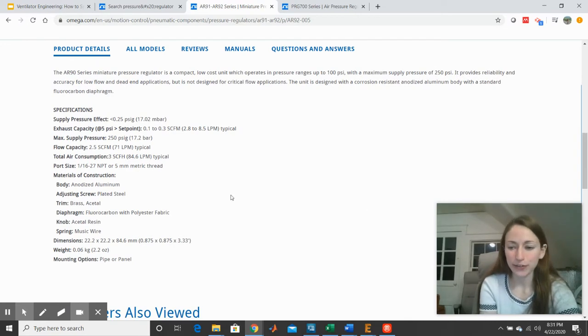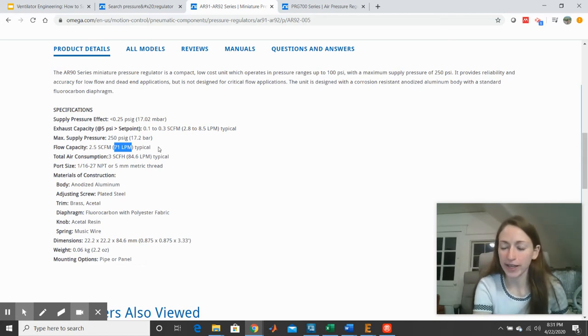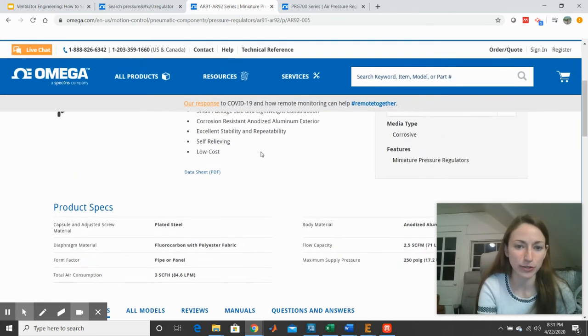And immediately, the first thing I'm going to look for is the flow capacity, because my suspicion is that it will not be able to flow enough for our application. And indeed, it looks like it probably might not. If you remember, our airflow specifications were that we were shooting for 60 to 120 standard liters per minute in terms of flow. But here, it looks like we're limited to around 71 liters per minute. So this may indeed be too small for us.